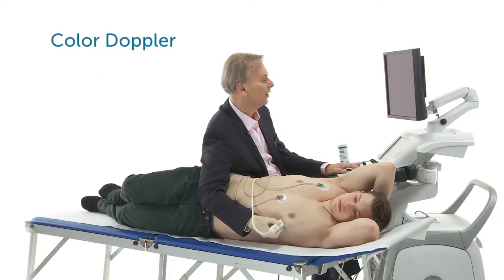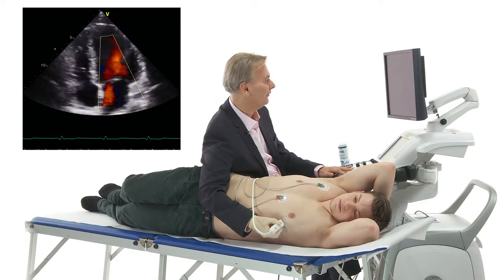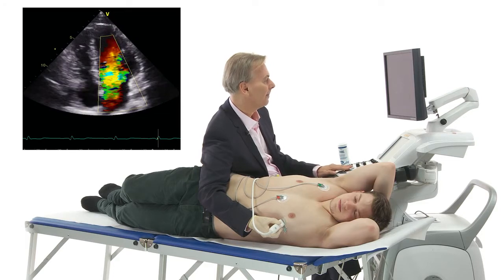But before we really detect mitral regurgitation, we have to understand how color Doppler works. And this is going to be the next part that we're going to look at in our patient demo. First, we turn the color Doppler on. And then we get the color Doppler information in the region of interest, the color box. How do we interpret the different colors we have? Well, let's freeze the image.